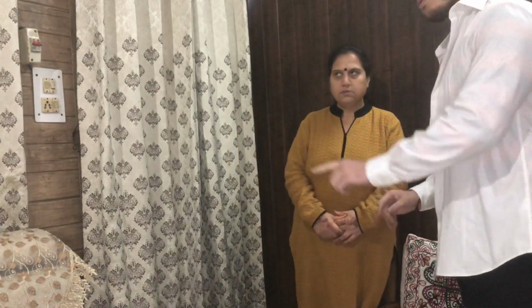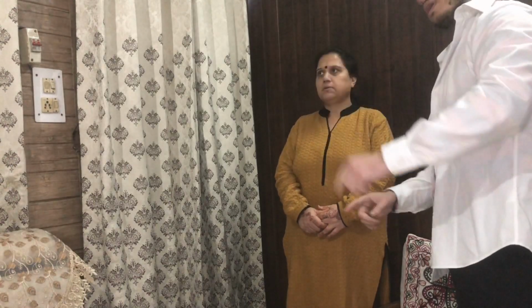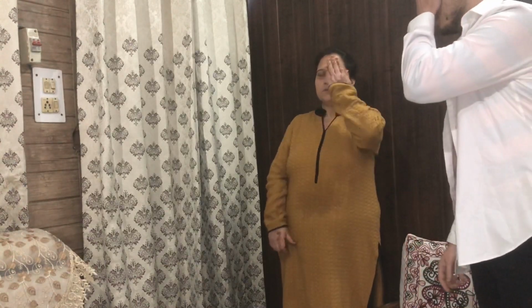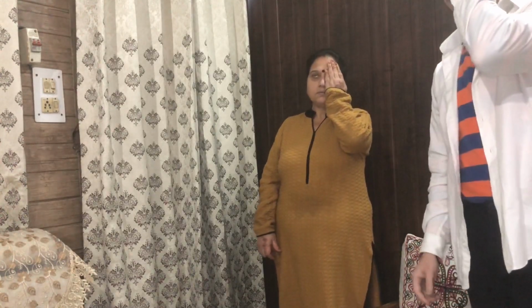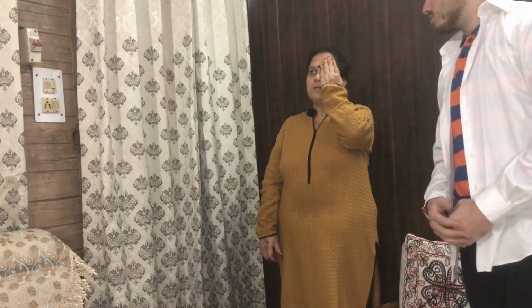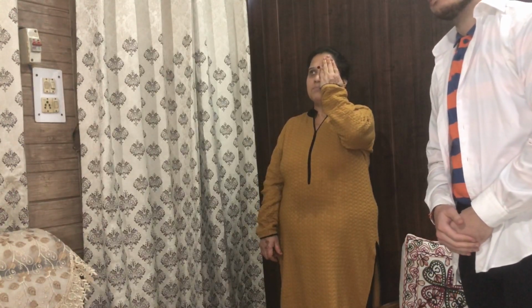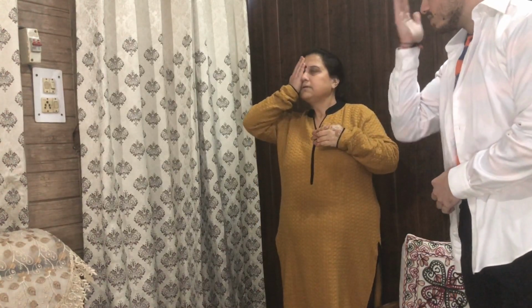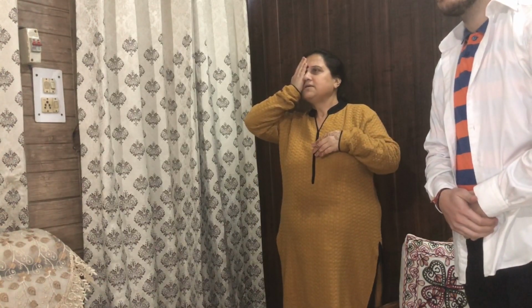Now start the examination with the visual acuity test. Ask the patient to stand 20 feet from the regular Snellen chart. Always test the right eye first, so ask the patient to cover her left eye first. And ask the patient to read the letters from the largest to the smallest. And similarly repeat the examination for the left eye.